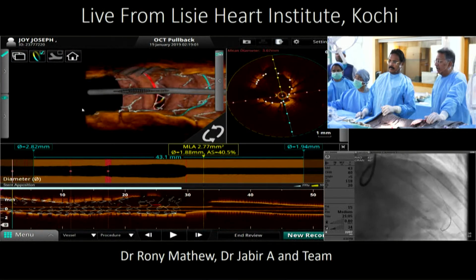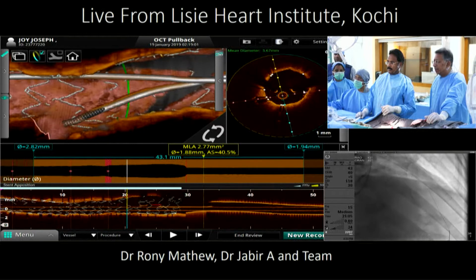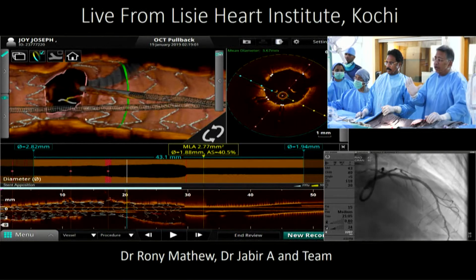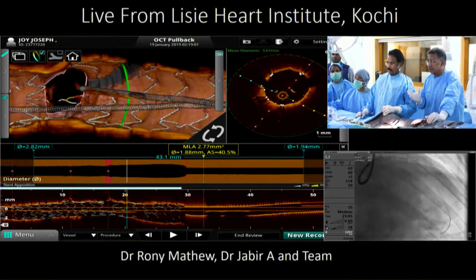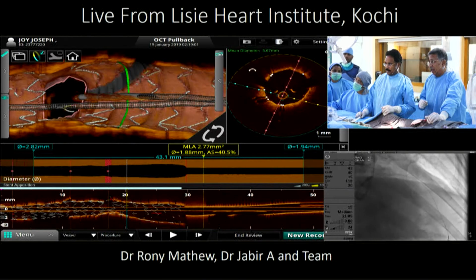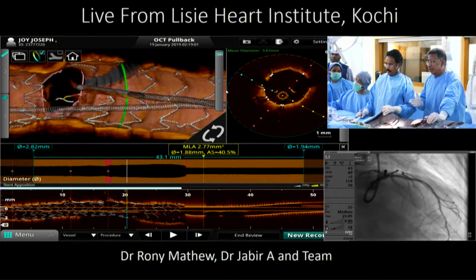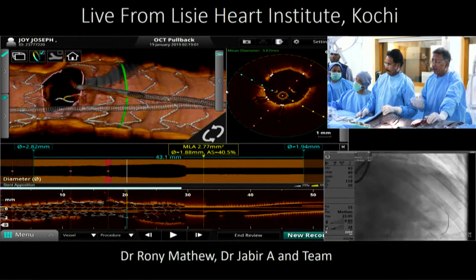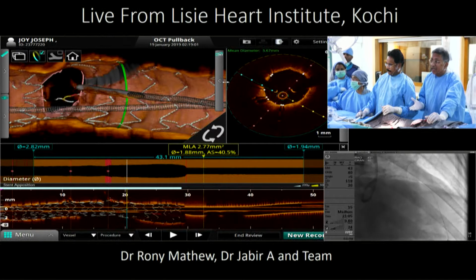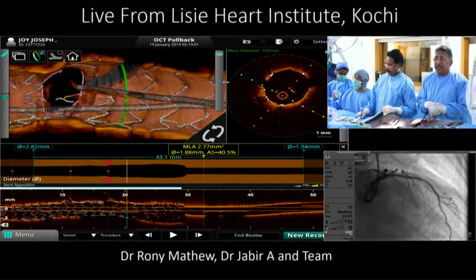No, I think what Dr. Prabhakar said is very important, and it should be appreciated that if you really do not have a visible angiographic stenosis at the circumflex, what is the chance of restenosis? It's less, and that's acceptable. However, when we have some pictures that show that if you leave a strut right across the circumflex ostium, there is a chance for neointimal proliferation that decreases the size. We need data for this, but until then, we could have different people thinking and different viewpoints on this.